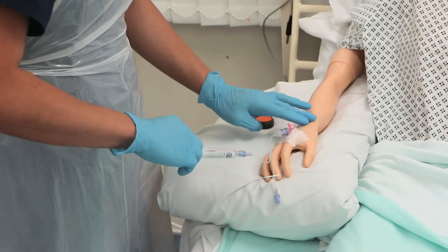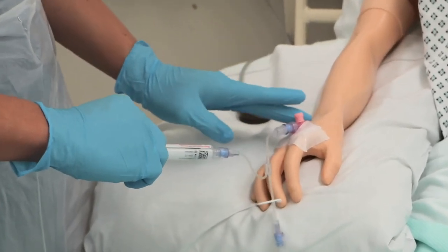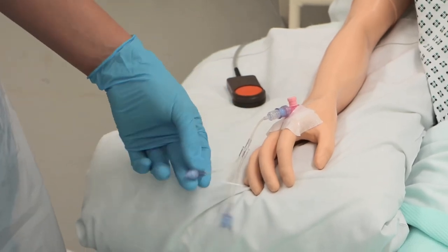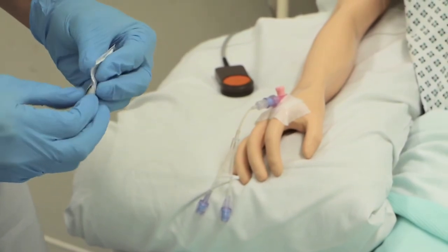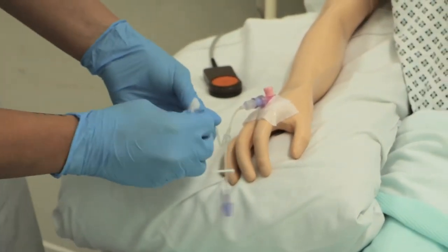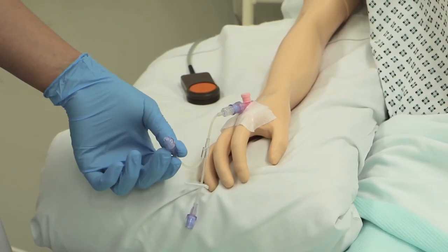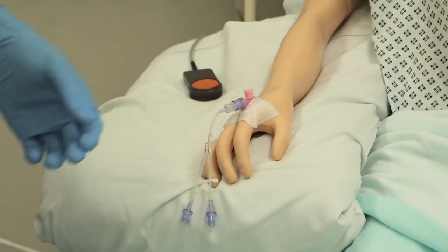Catherine, I'm going to start the flushing now — please tell me if you feel any pain so I can stop right away. How are you feeling? — It's all right. Now I'm done. This goes to the clinical waste bin. I need to clean the port again using my second alcohol swab in the same manner — inner to outer, circular motion — for 30 seconds, then letting it dry for another 30 seconds. This second swab also goes to the clinical waste bin.